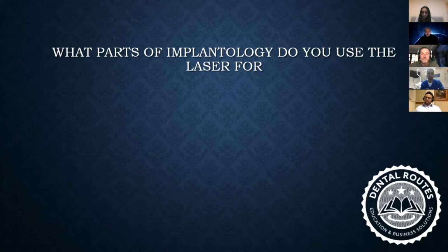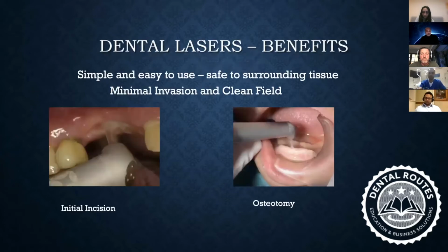So your first question is where I generally use dental lasers in implantology. At every stage, Chris, at every stage, because of the amount of advantage the dental laser gives me in terms of doing the procedure, in terms of patient experience, and in terms of the overall outcome I consistently get when I use a dental laser as an adjuvant with all the traditional steps that I use when I'm placing a dental implant in a patient's mouth.